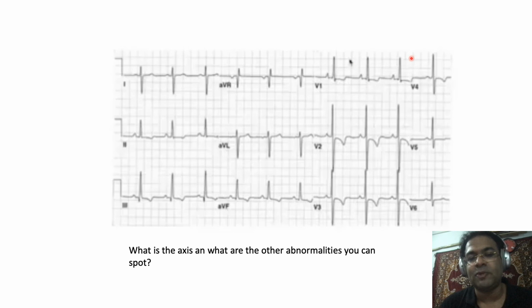If there is an abnormality in the heart, then this rule is broken. Therefore, this patient has right ventricular hypertrophy, because of which repolarization of the right ventricle is improper, and there is T wave inversion and even ST segment which is not normal in V1, V2, V3. We will deal with this in the later classes, but this is nothing but right ventricular strain.